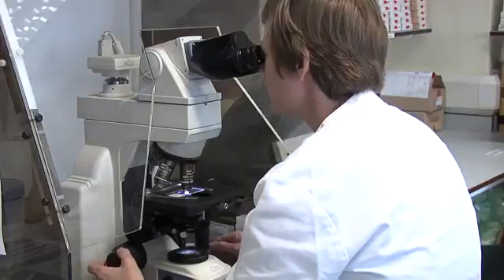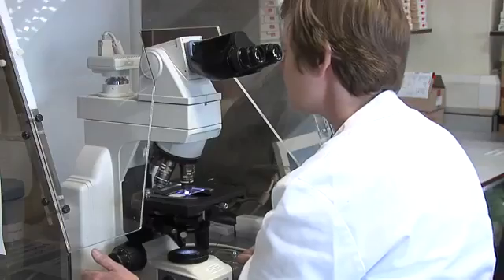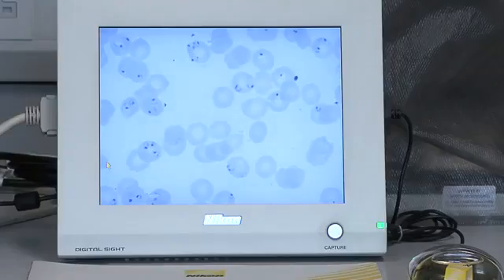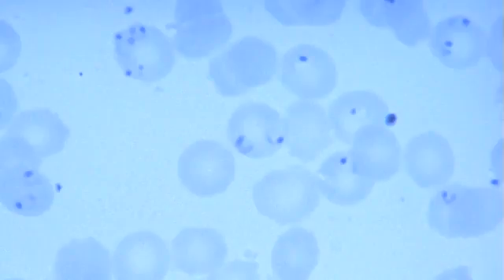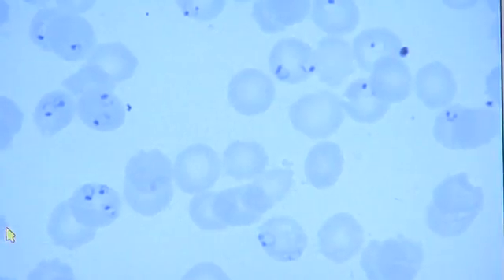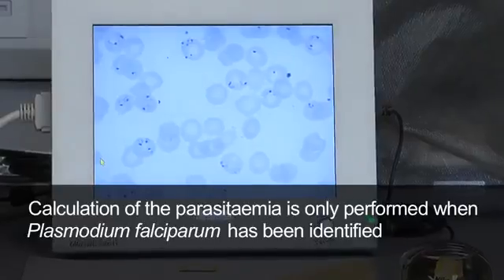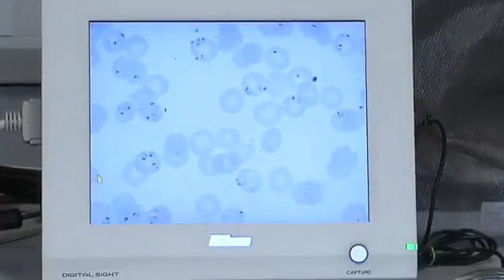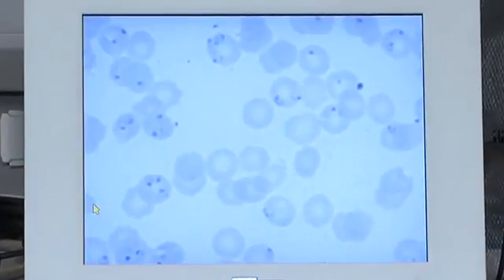Under the microscope we have a thin film. The eyepiece is times ten and we have an oil immersion times one hundred lens, giving a thousand times magnification. We're looking at the red cells, which are the grey circles, and inside them you can see red dots with blue cytoplasm — the nucleus and cytoplasm of the parasite. This film has a very high parasitemia of approximately 37%. When doing a parasitemia you count the number of parasitised cells. The stage shown is the ring form, or trophozoite stage.